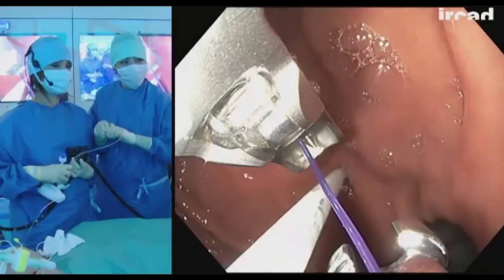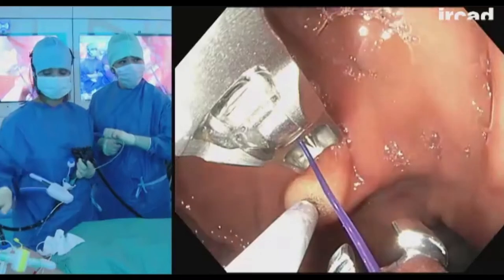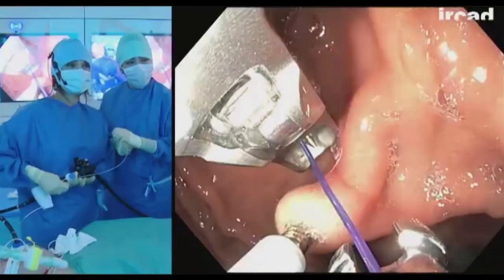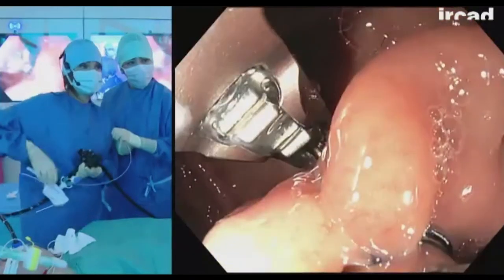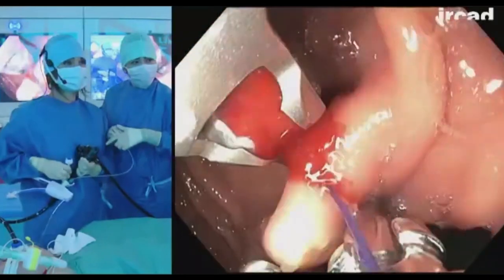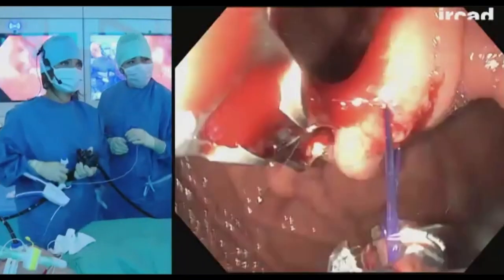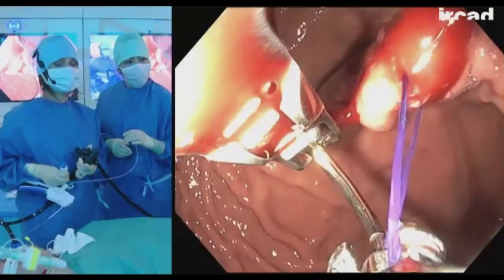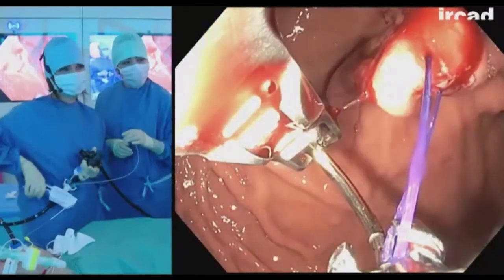One, two, three. As Manuel would say, one for you, one for me. And then I'm going to re-enter the scope so that I can have a very nice full thickness bite. Rita is reversing. A little bit of blood is nothing. It's normal. Usually the drop of blood is always on the camera.